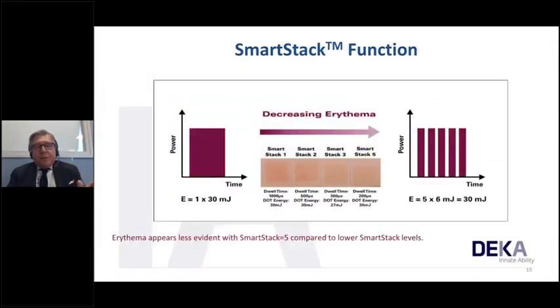You see the comparison between stack 1 and stack 5. We can get the same total energy, in this case 30 millijoule, but reducing the erythema of the skin, while getting the same results. So it's a safer modality to have the results.